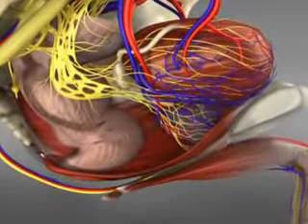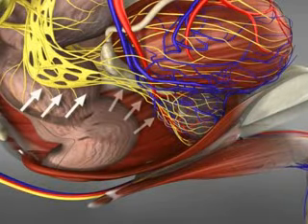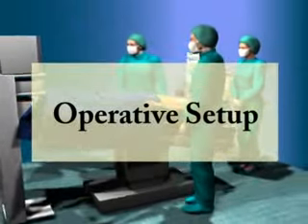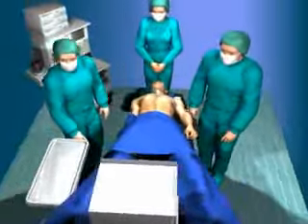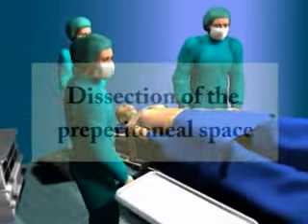In intrafascial nerve-sparing radical prostatectomy, the pelvic plexus, the neurovascular bundle, and the prostatic plexus, a distribution of nerve fibers on the lateral surface of the prostate, are preserved in order to obtain the neurovascular integrity. Endoscopic extraperitoneal radical prostatectomy, a strictly extraperitoneal procedure, is usually performed with the patient under general anesthesia.